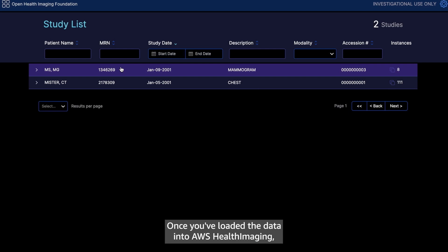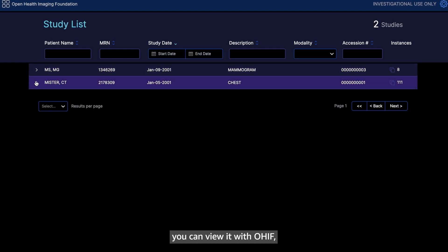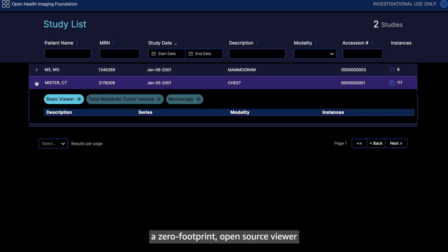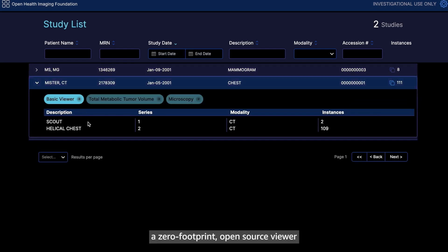Once you've loaded the data into AWS Health Imaging, you can view it with OHIF, a zero-footprint, open-source viewer that uses accelerated cloud-native APIs.